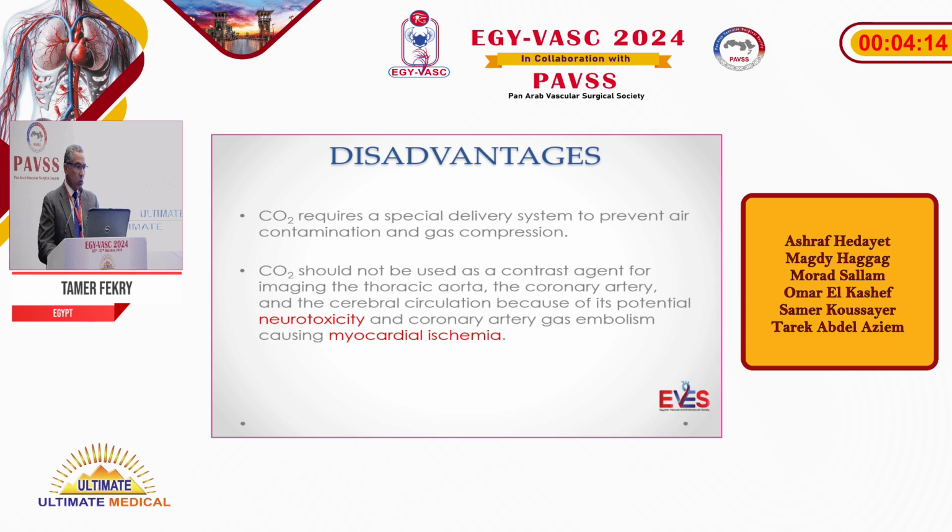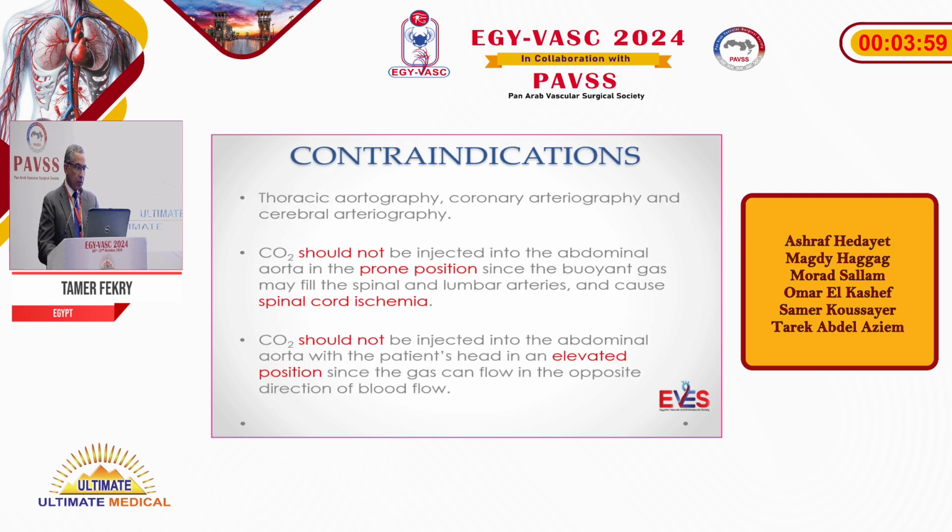CO2 shouldn't be used as a contrast agent above the diaphragm because it has a neurotoxic effect and can cause myocardial ischemia, so it's not advised to inject it above the diaphragm or into the cerebral circulation. It's contraindicated in thoracic aortography, coronary arteriography, and cerebral arteriography.